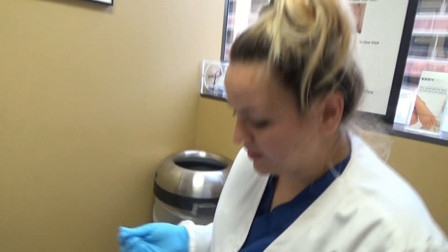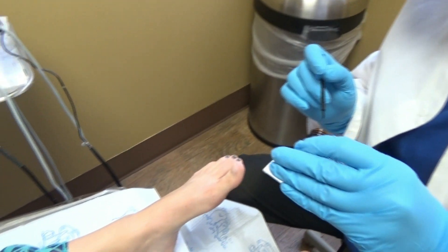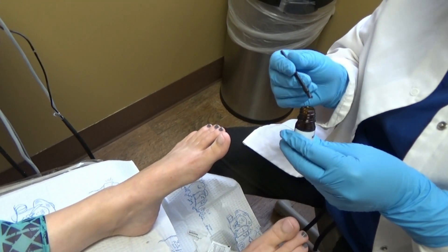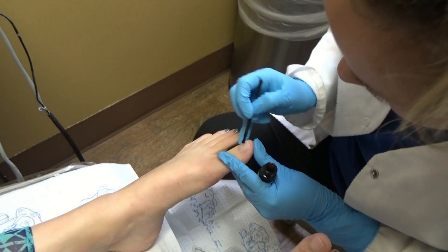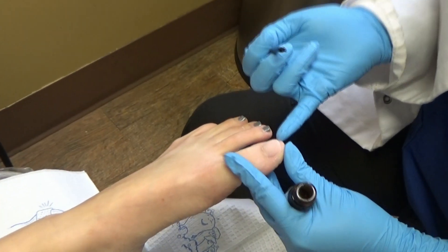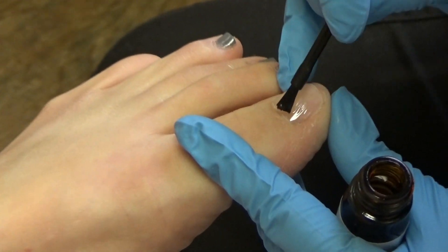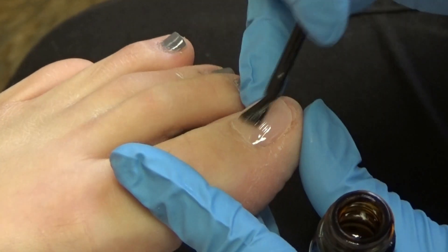So now we're going to apply the seal, which is basically like a top layer, the final layer. It does leave a shiny finish to it, but if it's a male patient and doesn't want it to look glossy, we can always buff it down. We do have to apply it — it kind of just bonds it together.